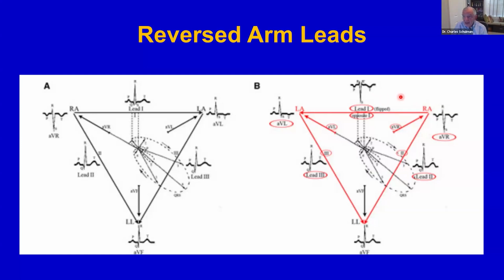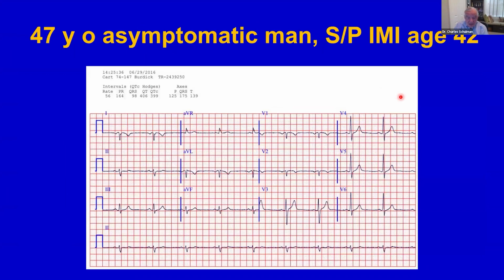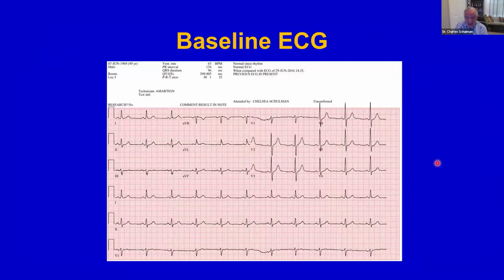So we can go back and look at it. You see, in fact, this is upside down. This is really AVL. This is really AVR. See?